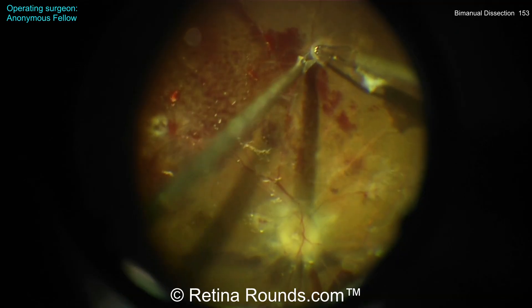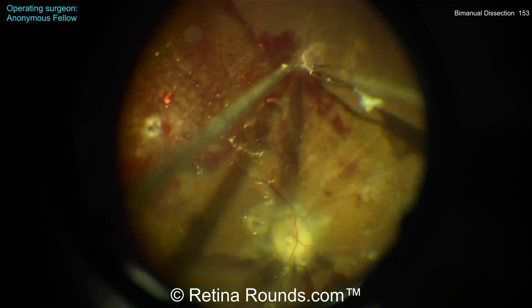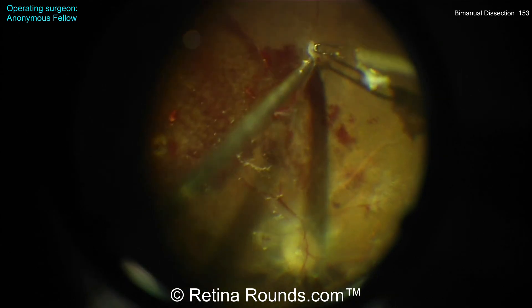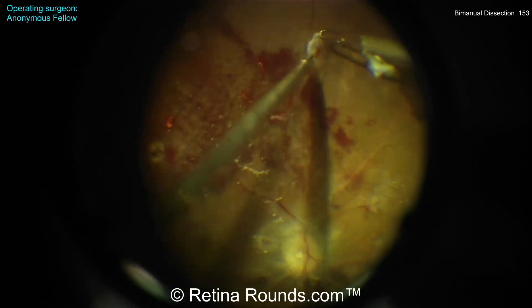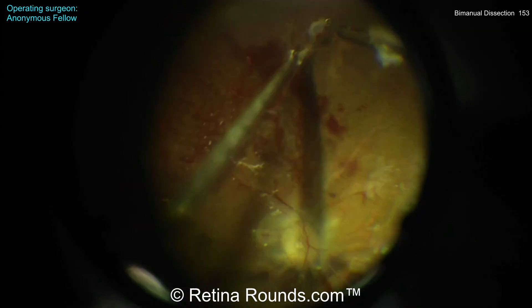Now again, using the forceps to hold that membrane back — I'd like to see that membrane being folded back a little bit more so that we can see this interface. And you can see here that the scissors are being used to cut this fibrovascular peg from the retinal surface.